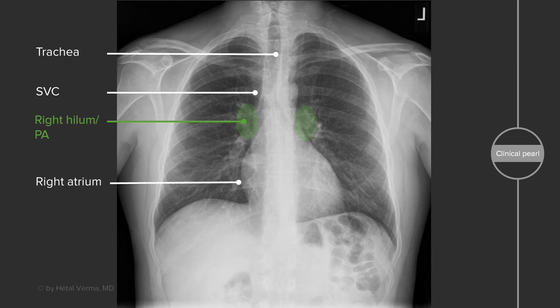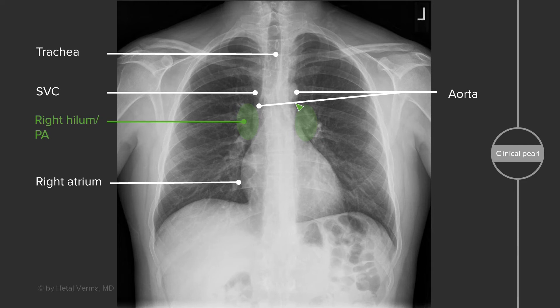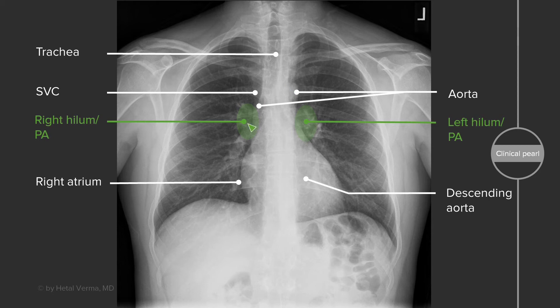You want to take a look at the right atrium, which is the right heart border. The entire right heart border on a frontal film represents the right atrium. You can see the aorta — a portion of the ascending aorta as well as a portion of the descending aorta on a chest radiograph. Again, this is the left hilum, and a portion of the pulmonary artery is also present there. And here you can see behind the heart a shadow of the descending aorta.